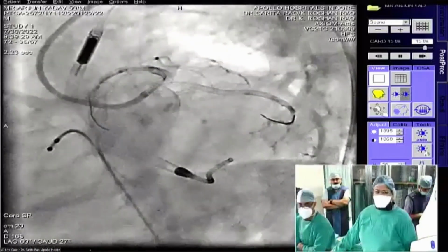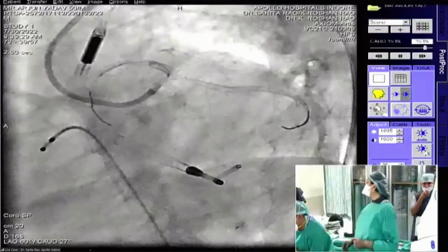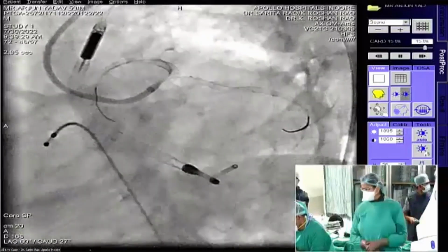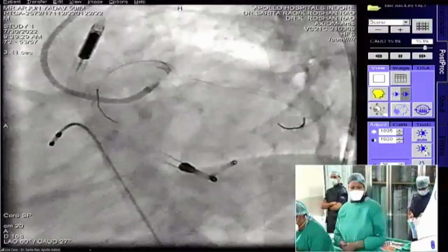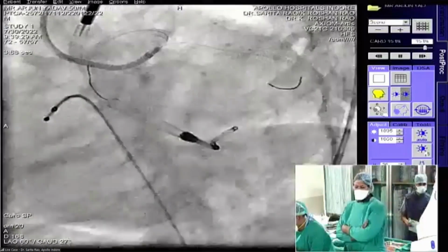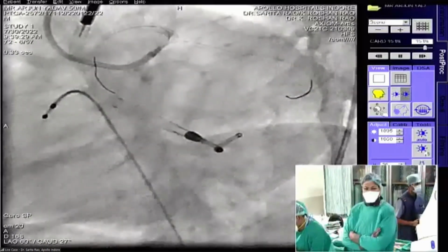Okay. OCT wise, how much area did you get in the left main? Raj, can you tell me what was the OCT area? With the 4x6, we had gone up to 20 atmospheres pressure. And after listening to your discussion, I think I agree with Dr. Dagubati and with the rest that I don't want to touch that circumflex.